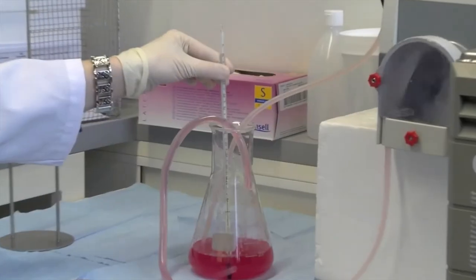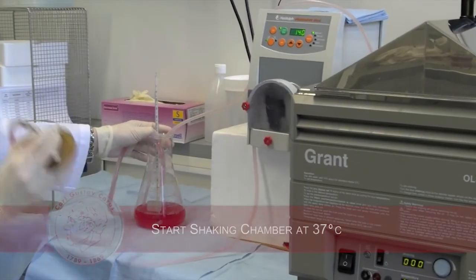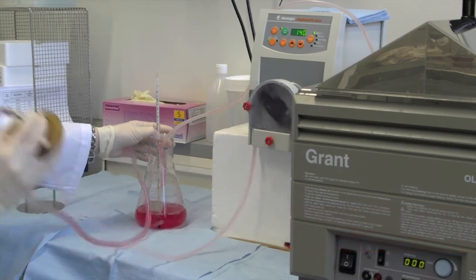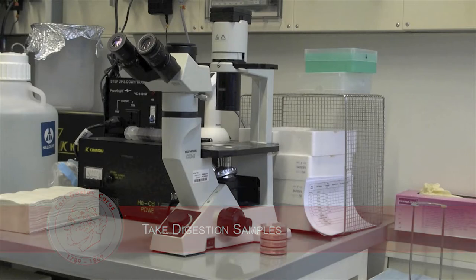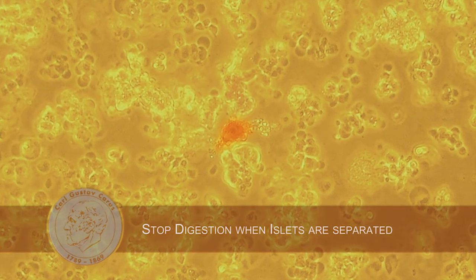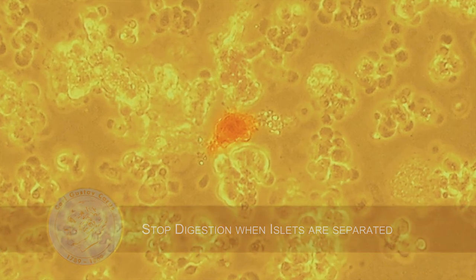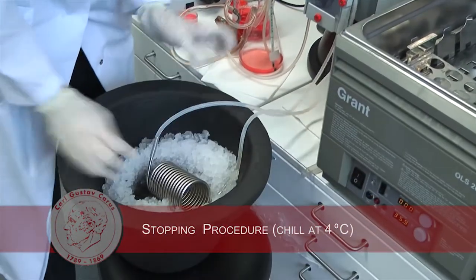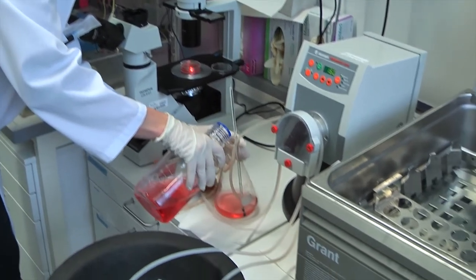Once the temperature of the circuit achieves 37 degrees Celsius, we start to measure the time of digestion. The Ricordi chamber is shaken by hand according to the tissue composition. To determine the optimal time point to stop the digestion, we take periodic samples. Dithizone stains the separated islets red under the microscope. Once the islets appear to be separated from the acinar tissue, we quickly stop the digestion by putting the heating coil on ice and adding 200 ml of cold wash media to the circuit.